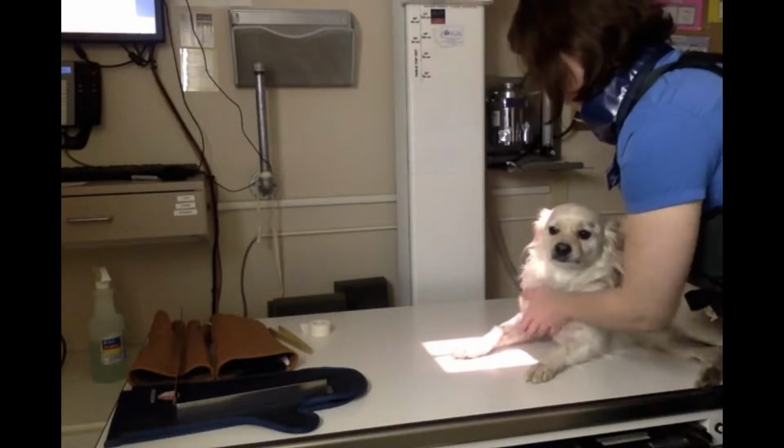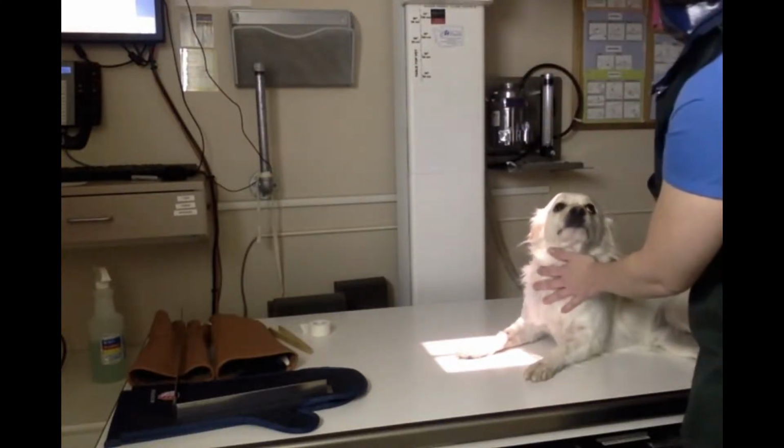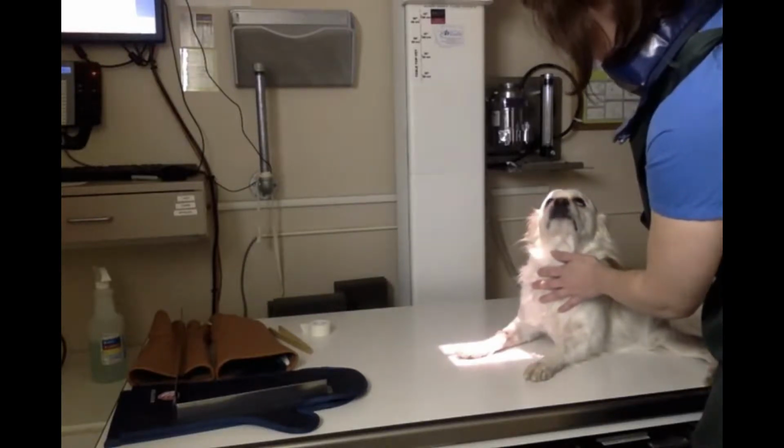So now I'm going to make sure that that is in the primary x-ray beam. I'm going to collimate down.